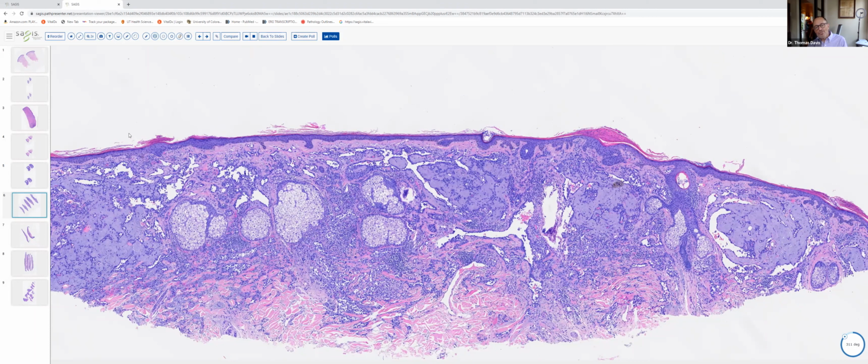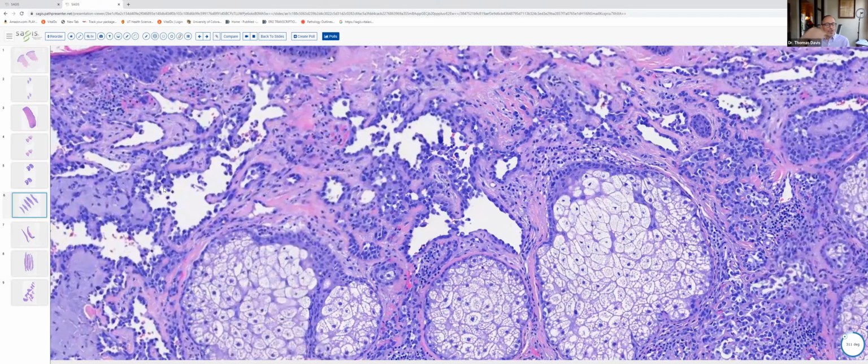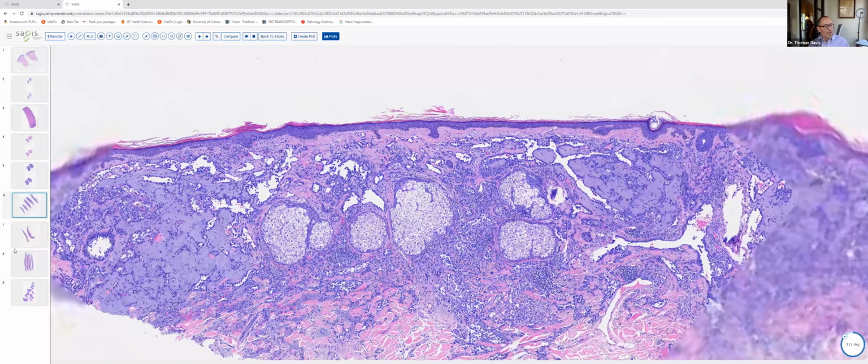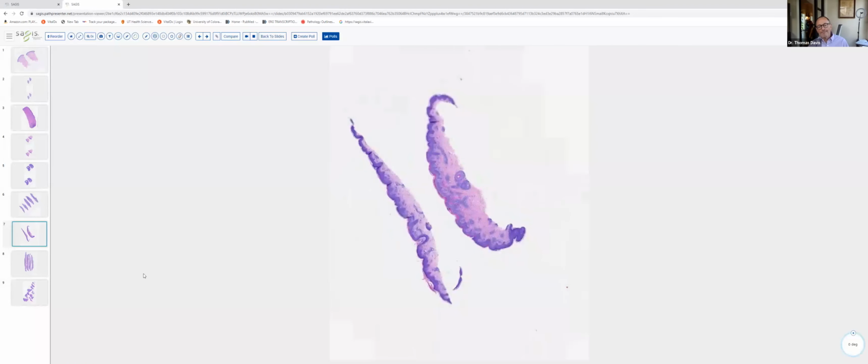So this is an angiosarc. One could confirm the vascular nature of this tumor with endothelial markers, and good vascular markers that we tend to use for endothelial lineage are CD34, CD31, and ERG. ERG is a nuclear marker, and it's particularly clean, a very, very good marker. So angiosarcoma here. Go ahead and move on to slide number 7.